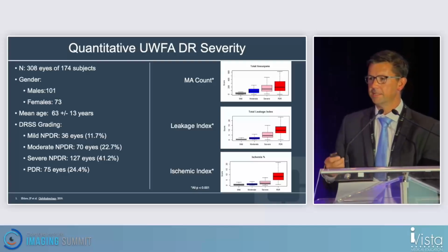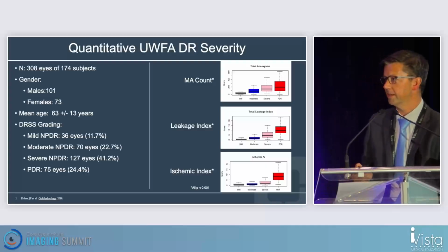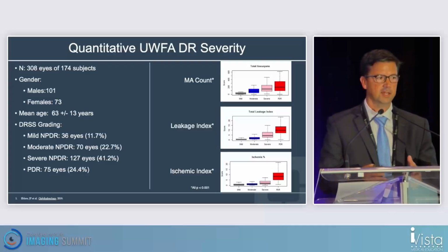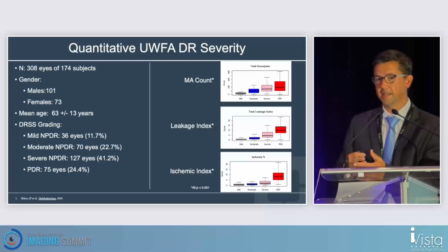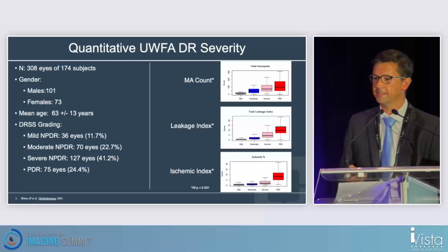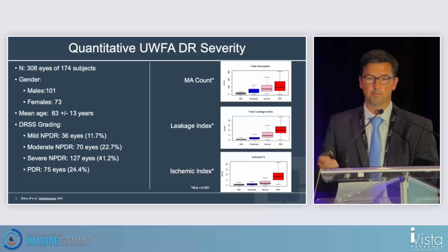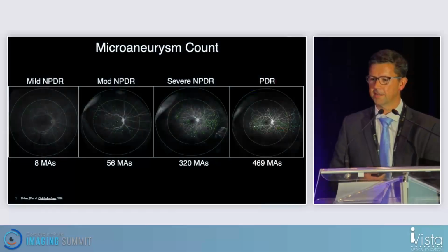But interestingly, just because that's the way we graded it before doesn't mean it's the way we should actually grade it in the future. In fact, particularly in the moderate diabetic retinopathy and the severe diabetic retinopathy, there's some eyes that just stay that way long term, and there's other eyes that progress really, really fast. There's some suggestion that maybe some of these angiographic features may be perhaps the most critical in understanding these phenotypic variations that are there.